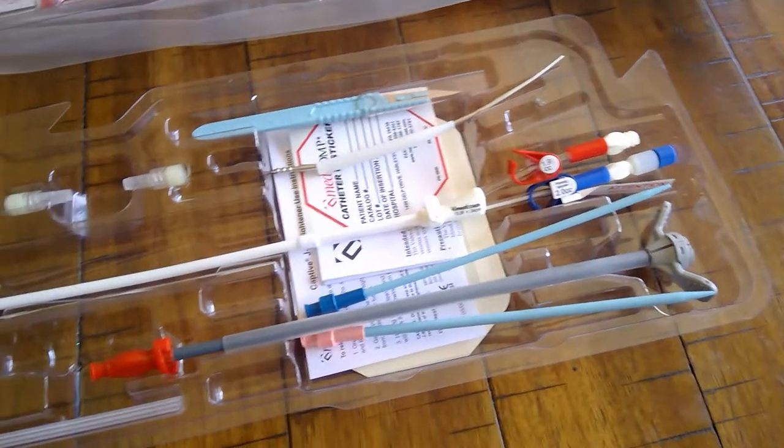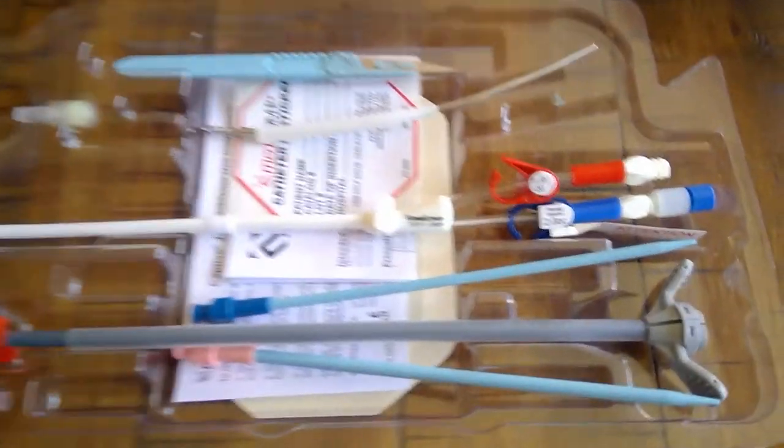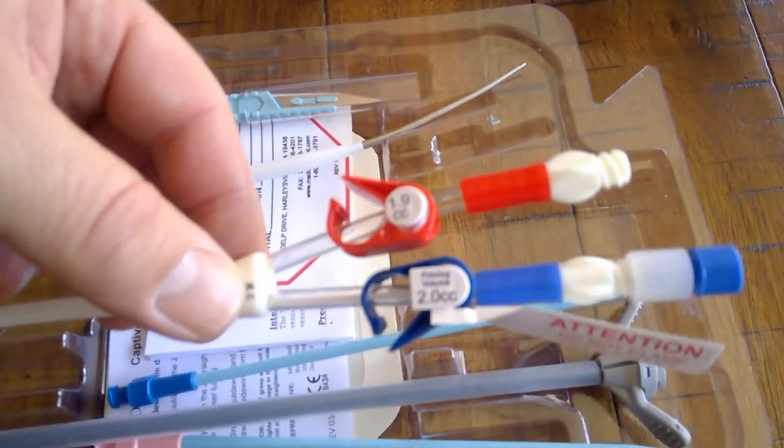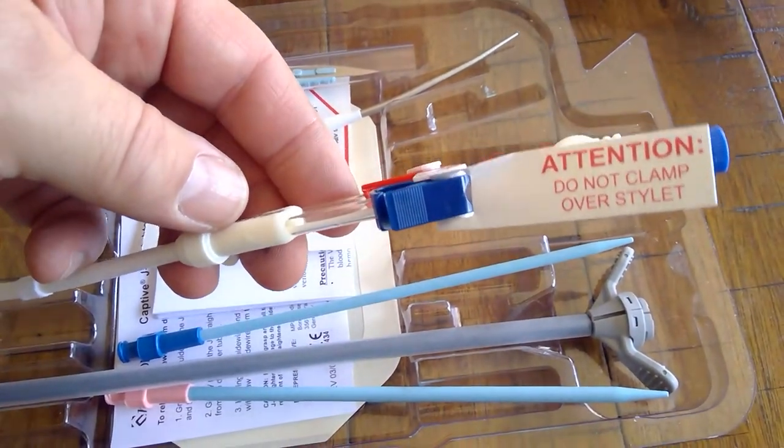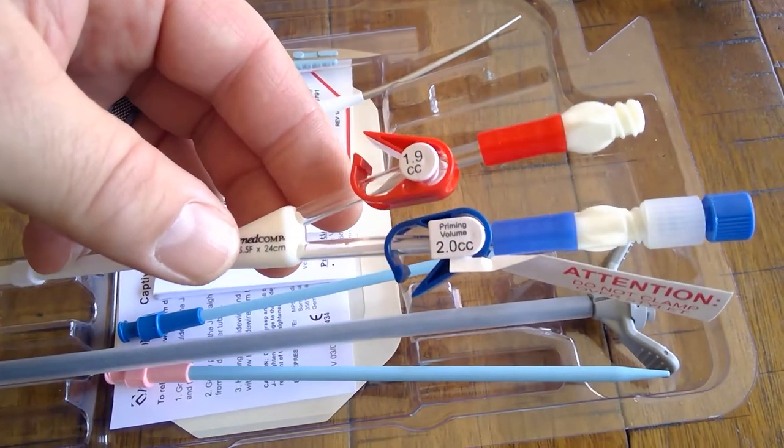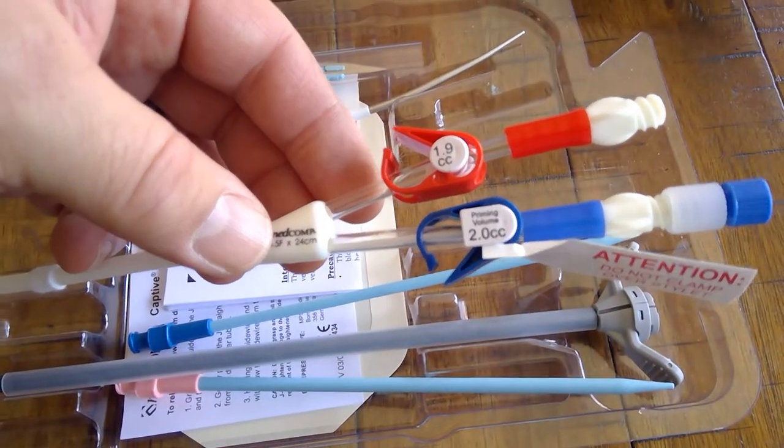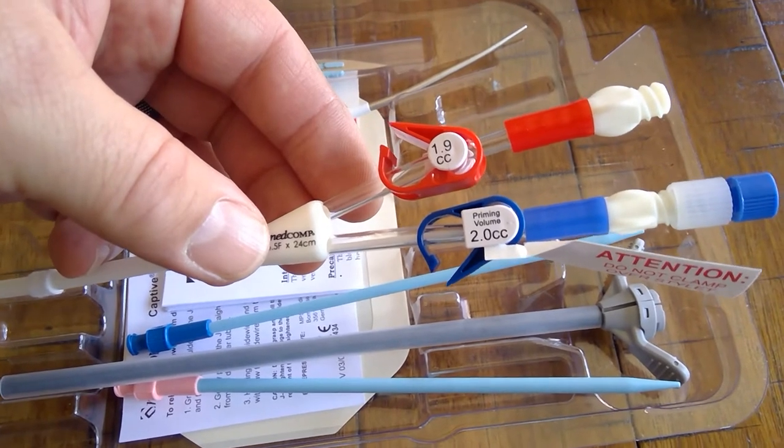Interesting part about this dialysis catheter is it comes with an exchange dilette already inserted through the blue lumen. It has a little tag that says do not clamp over the stylet. You do not want to clamp over that plastic stylet because you will kink it and it'll be hard to get over the guide wire.